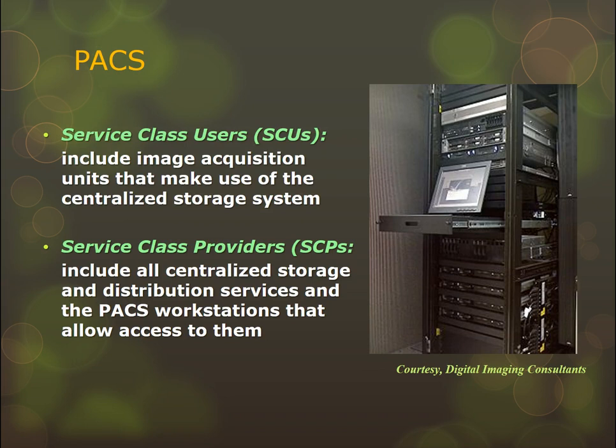When two DICOM modalities, or a modality and a PACS, get together, there's two sides to that conversation, right? So you have a service class user, and this includes image acquisition units that make use of a centralized storage system. They are users or requesters. They're requesting a service from PACS. Hey, can you store my images? And you have service class providers. These include all centralized storage and distribution services and the PACS workstations that allow them to access.